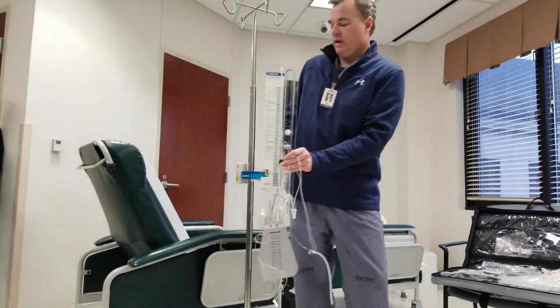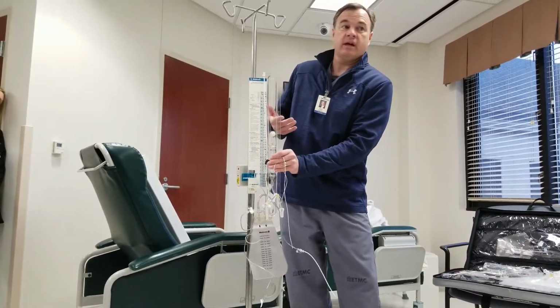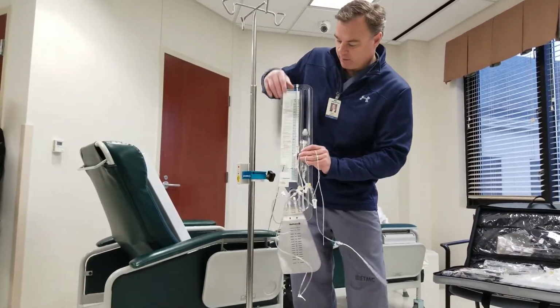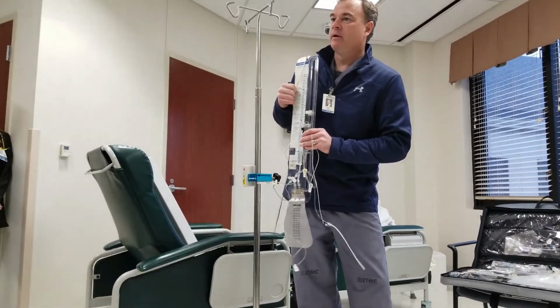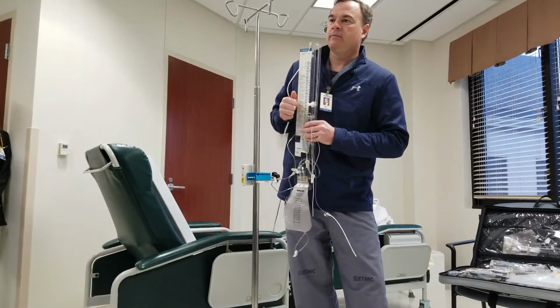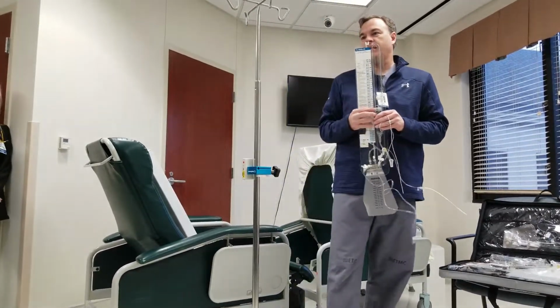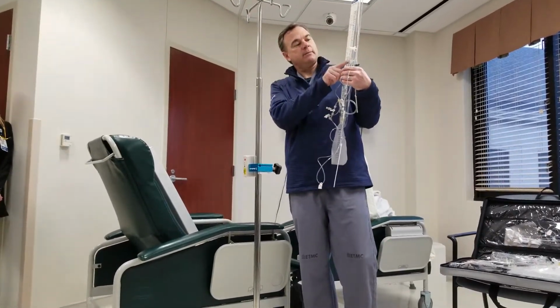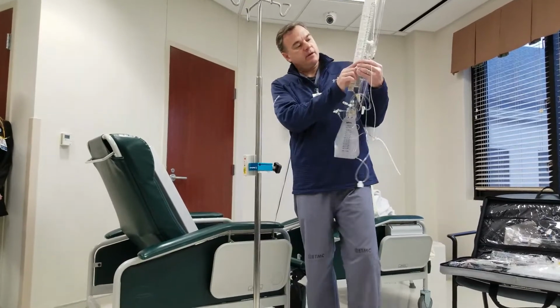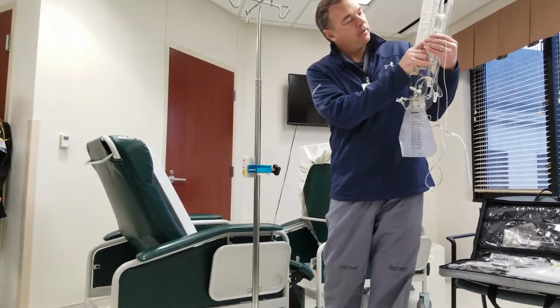So it's zeroed out, and then whatever the surgeon wrote the orders at, let's say 8, for example. There's mercury and there's water. Mercury is a European thing. You won't use mercury, you're going to use water. So that's centimeters of water. This comes down, you can see this is your reference point right here, so you would line that up with 8.